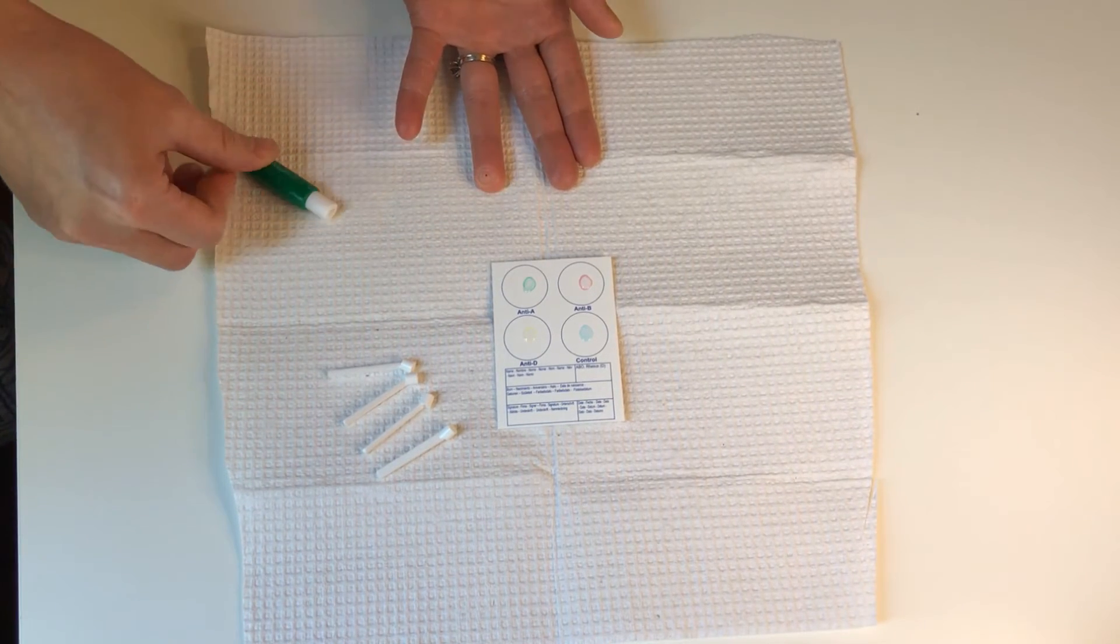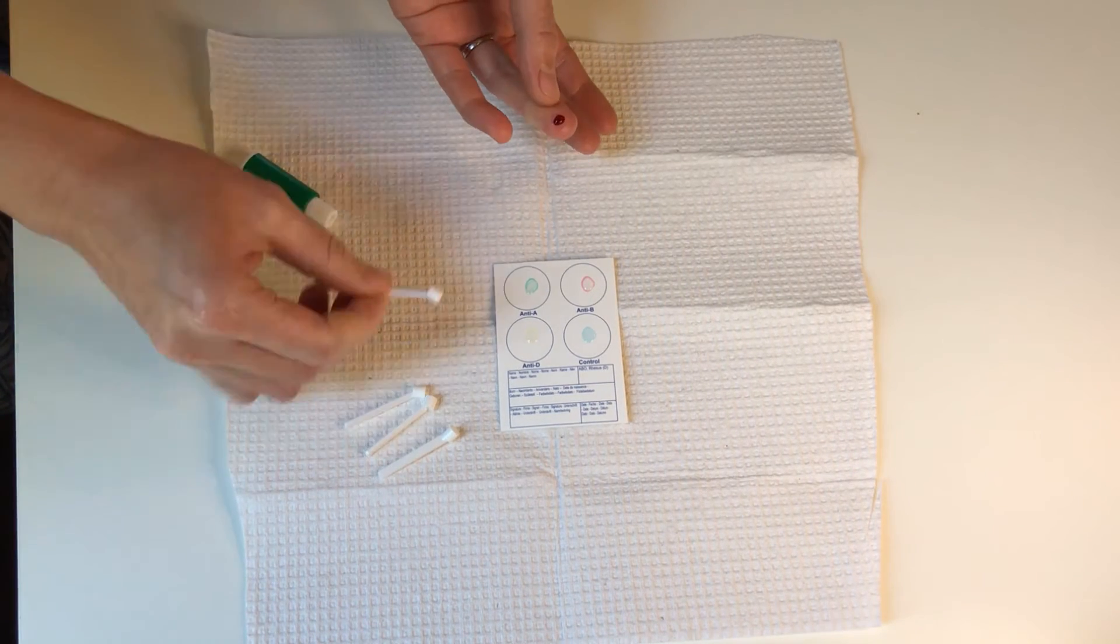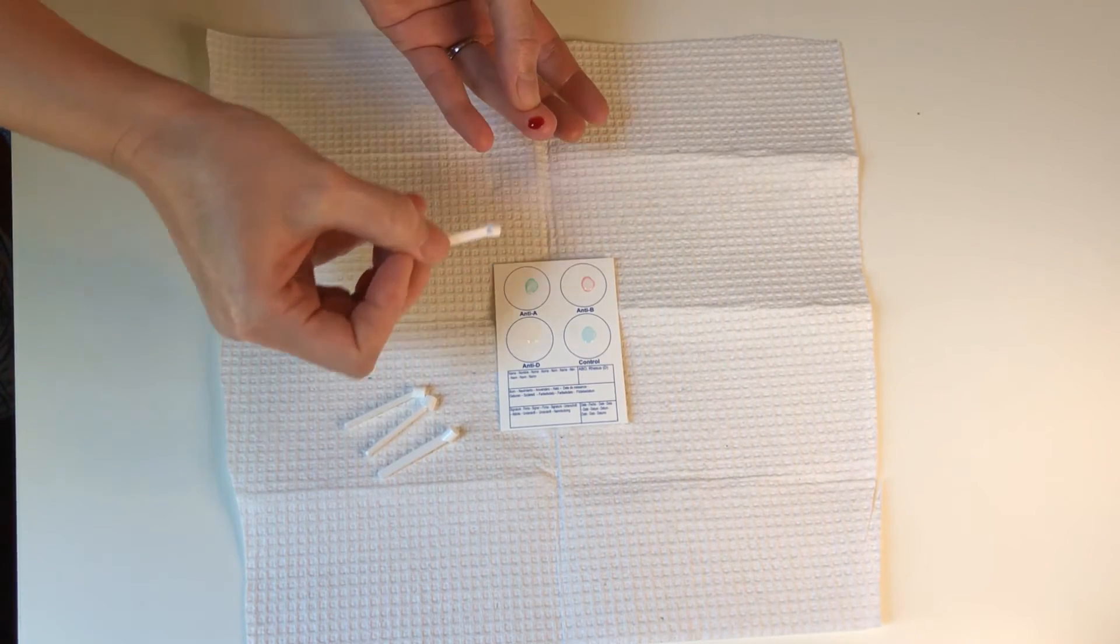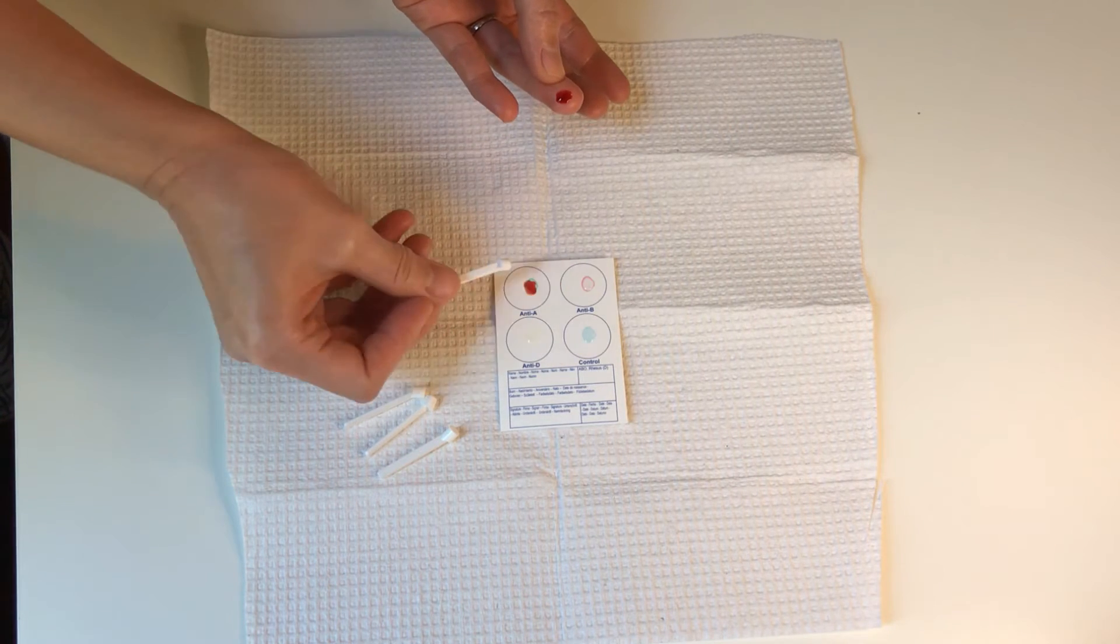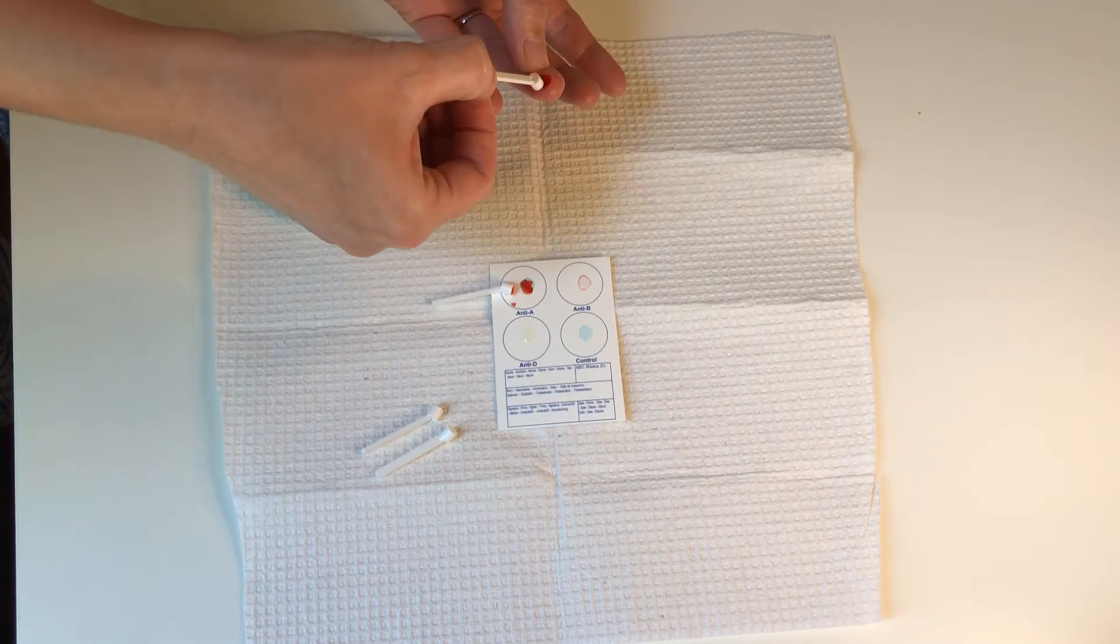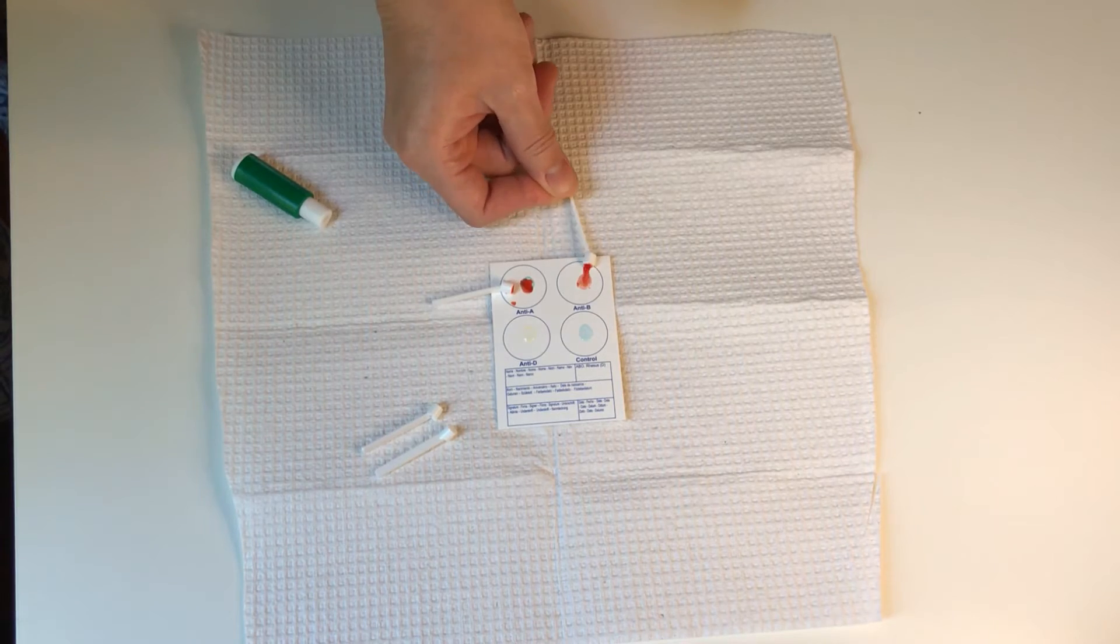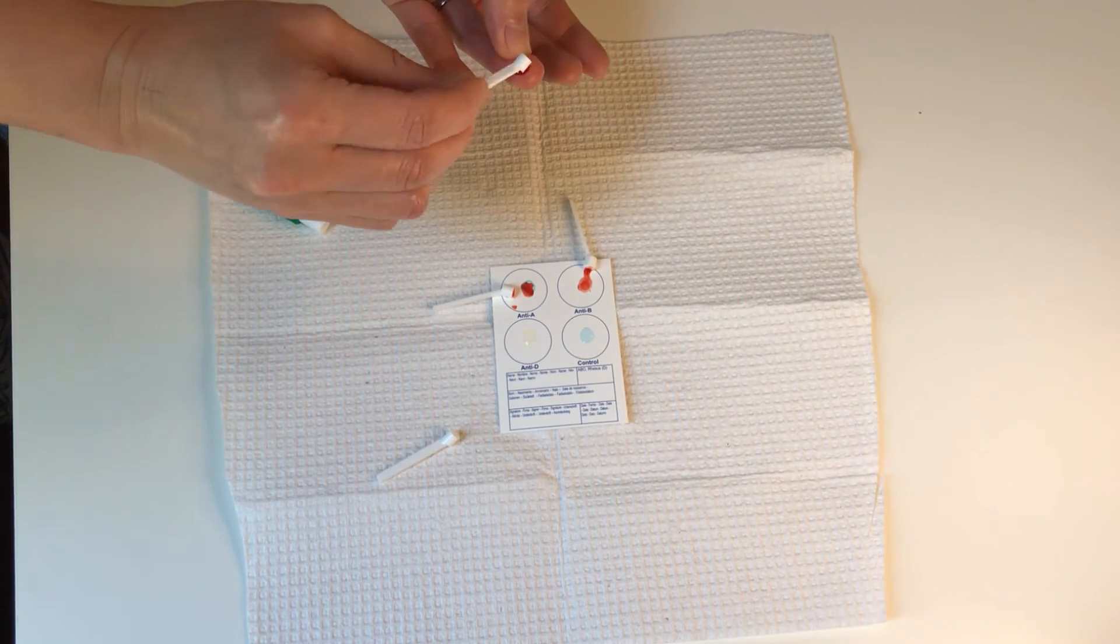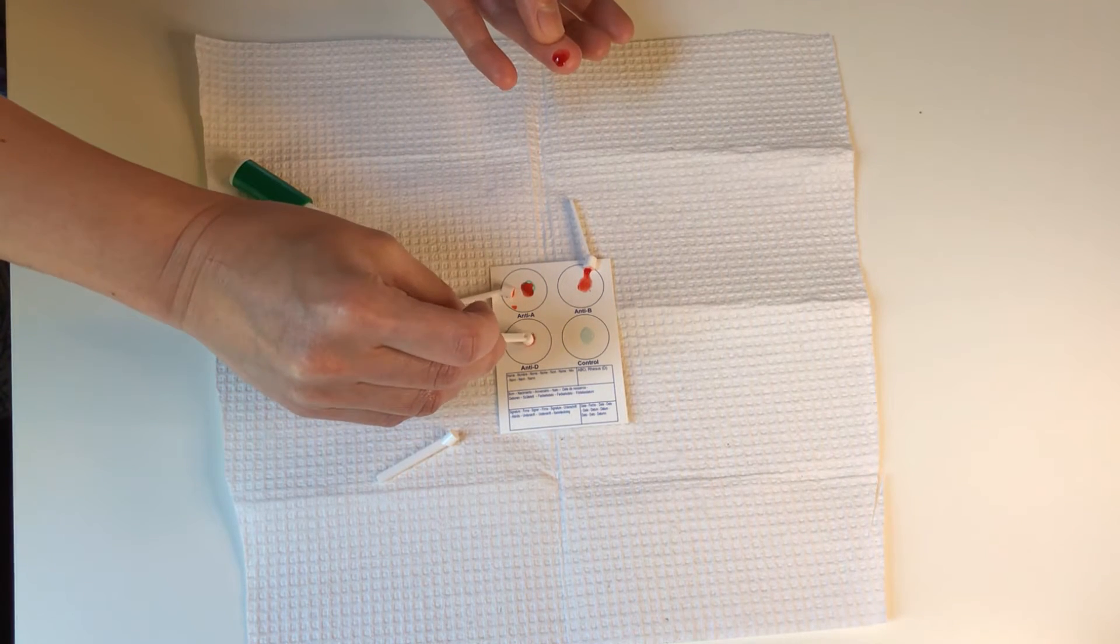There you go. Now get that, milk it. Good job, babe. I'm proud of you. That's a good one. Now grab one of those stickies. Swirl it around on the A. Swirl around. That's good. Same thing. Oh, careful, careful. She's doing great. Look at that blood flow. All right, looks good.